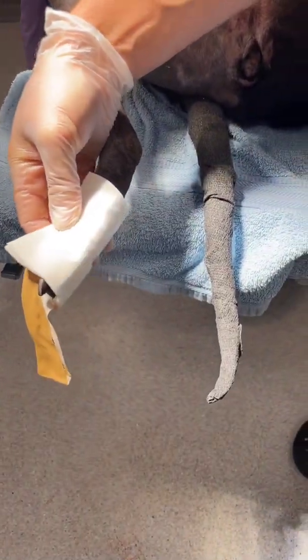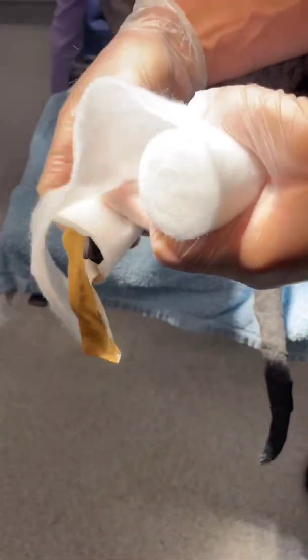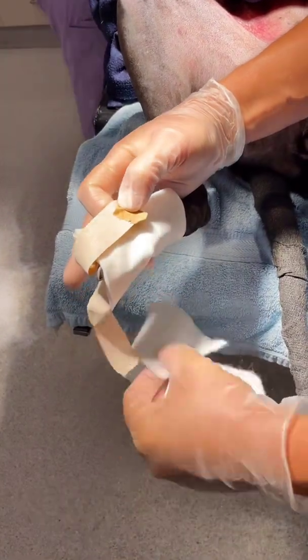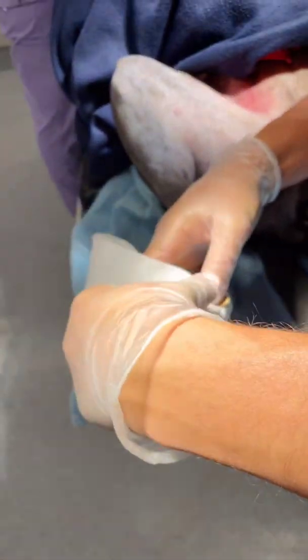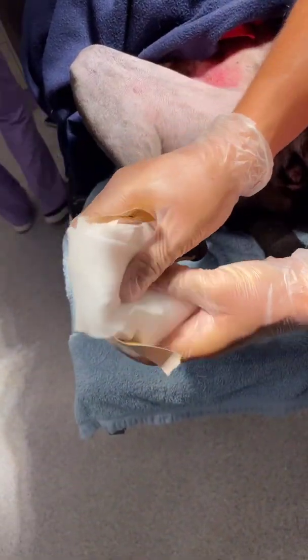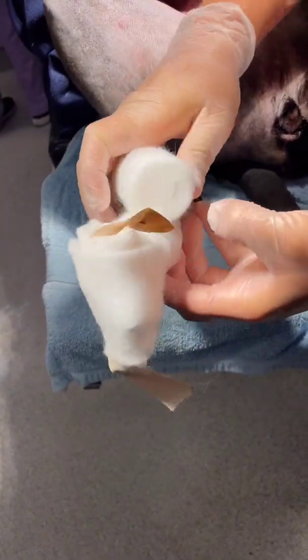Then I'm actually gonna create a kind of double thickness of the bandage. I've just folded that bandage back on itself and I'm gonna separate my stirrups here. This is the key trick — separating the stirrups is what's gonna hold it on. I'm gonna put the double thickness over the top of the foot and around underneath. I'm gonna leave my stirrups kind of as these ears on each side of the foot.